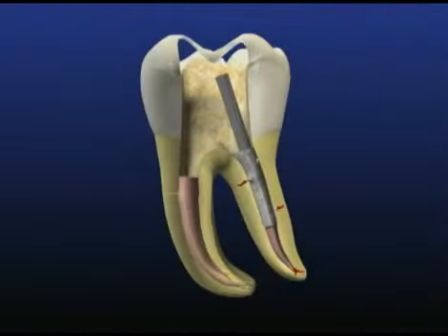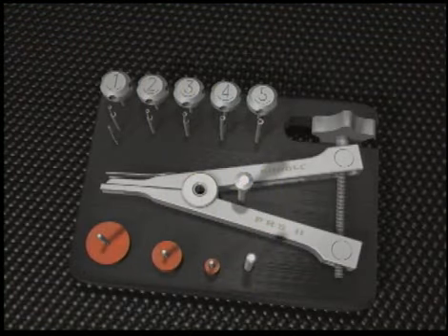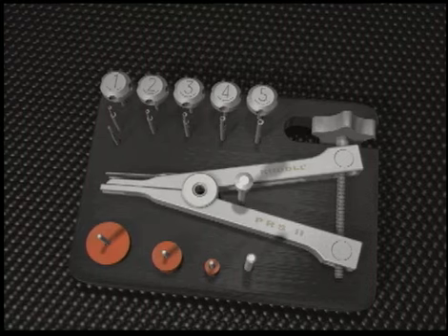Here we have an animated graphic of a mandibular molar demonstrating straight line access and a fully exposed post within the pulp chamber. When ultrasonic procedures prove unsuccessful, we need a fallback option. The PRS kit affords simplicity in use and provides extraordinary opportunity in predictably removing different kinds of post systems and other intracanal obstructions when ultrasonic procedures prove ineffective.